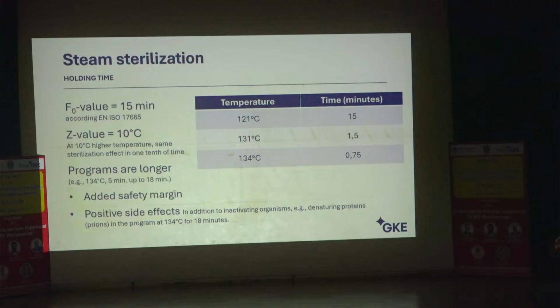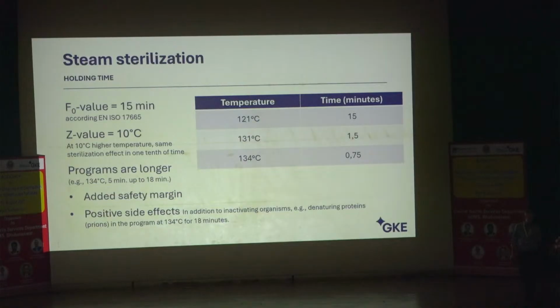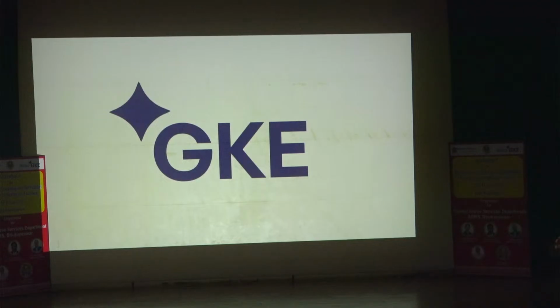And this is the challenge that has to be monitored, and this is why we have developed a method to monitor that. This is the method that we use in order to give you information in everyday life. And this information is provided by means of process challenge devices. So, let me end this presentation with this little quote that we can take from the general standard for validation.